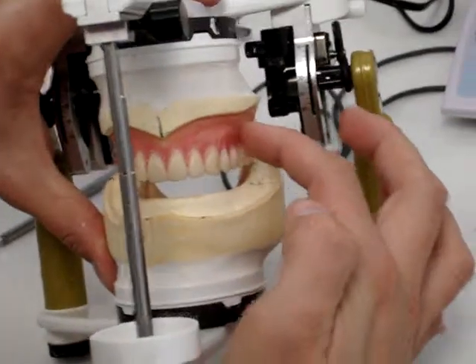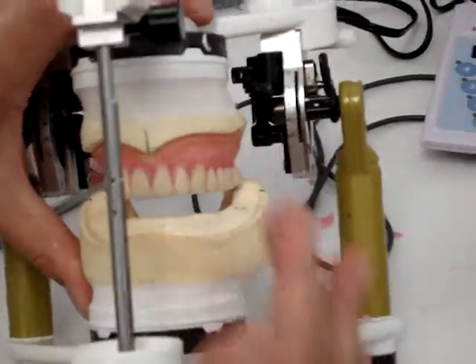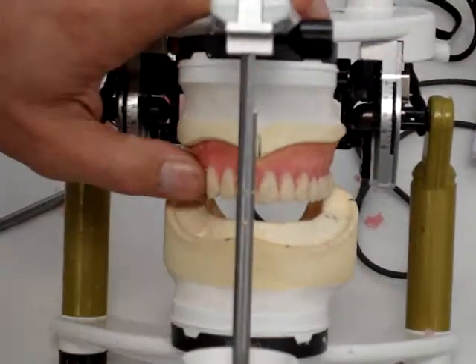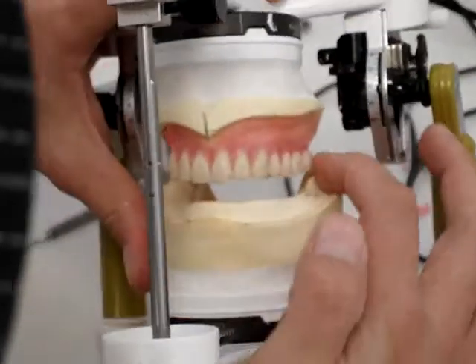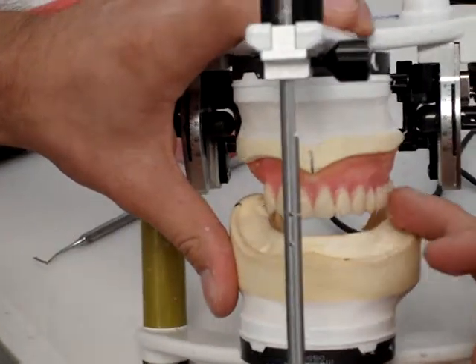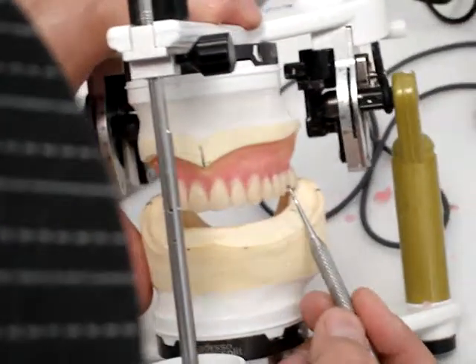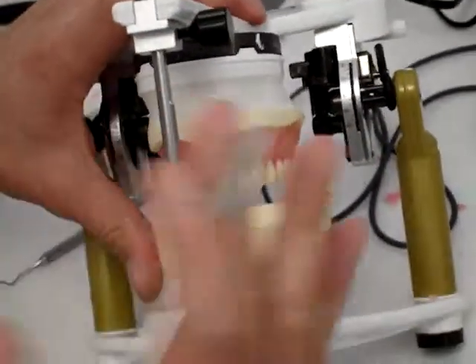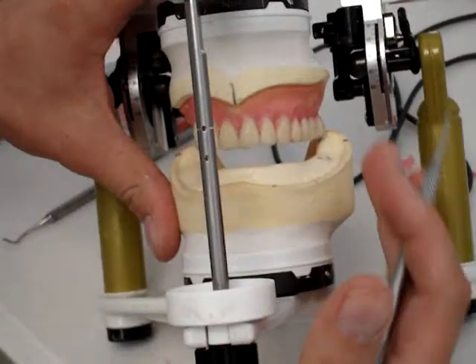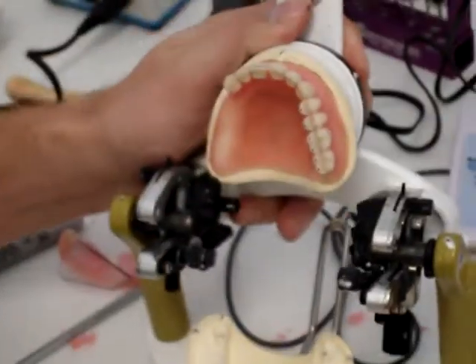It looks kind of weird when the wax is messy. It may not look right, but once you festoon and everything, it should look a lot better. But you just want to correct any gross things. Things should just be even. You shouldn't notice anything jumping out as you're going back. The teeth are nicely, you see about an even amount of change as you go from anterior to posterior.